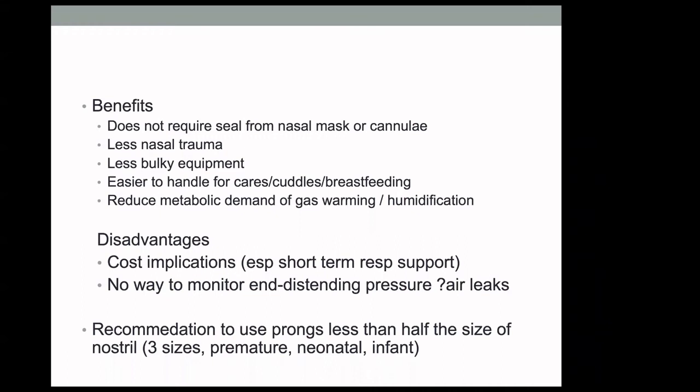However, the main disadvantage is that it's quite costly. Each set of tubing, when you start a baby on vapotherm, costs about £100. So it might not be the best option for babies who are unlikely to need non-invasive ventilation for a long period of time. It's probably more useful in a longer term setting.